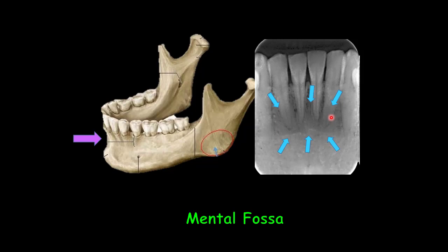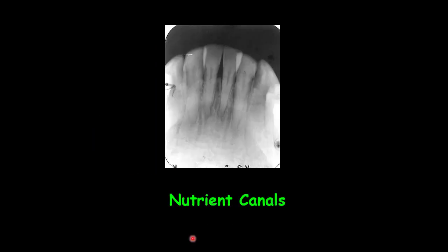The nutrient canals carry a neurovascular bundle and appear as a radiolucent line, uniform in width. They are most often seen in older patients and patients with advanced periodontitis, because bone thinning and resorption make them more evident. They are mostly seen on mandibular periapical radiographs, and can run vertically from the inferior dental canal directly towards the apex of the tooth, or they can sometimes be interdental.